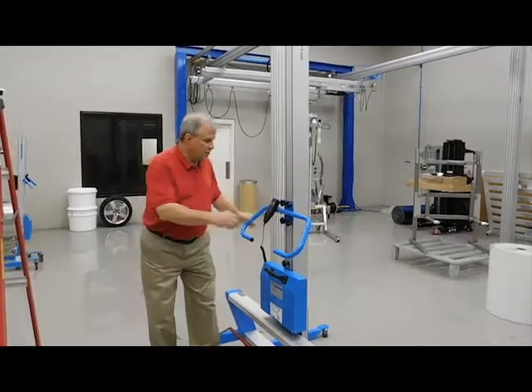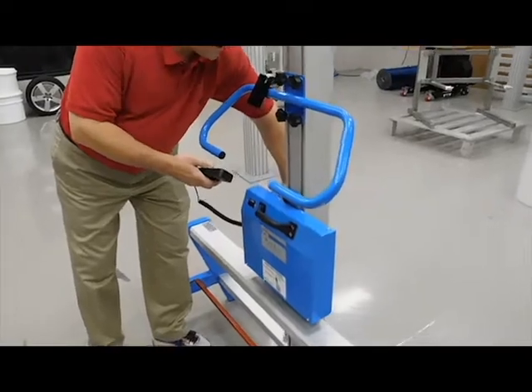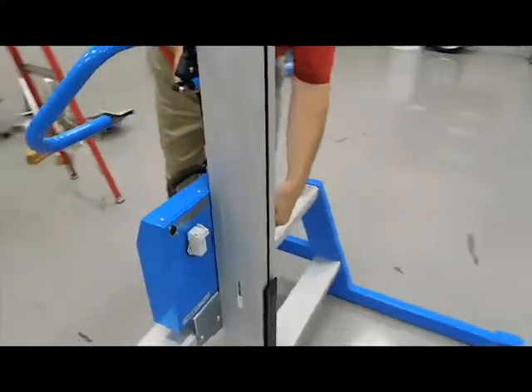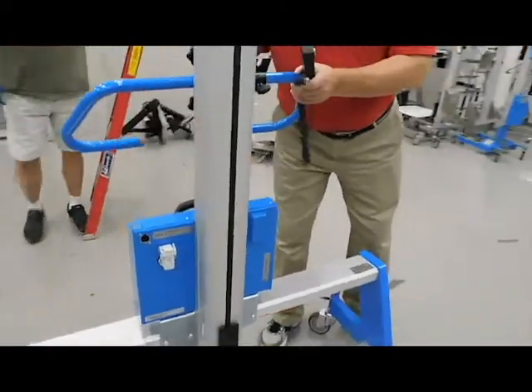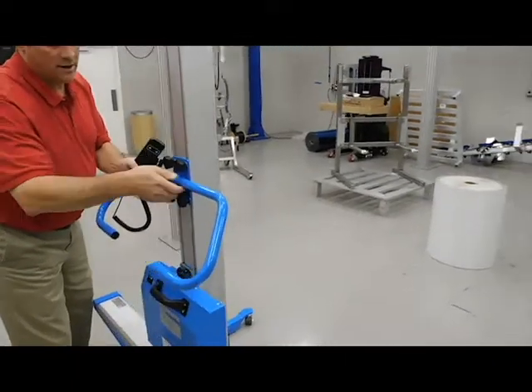The first thing that you would do is disconnect the 2-button remote from the back of the power pack. So that's done. And then there is a power cord in the back here that we're going to disconnect from the power pack. So that's done. And now we're going to get Craig to come over here and we're going to take the handlebar off. You have to take the handlebar off through the top of the mast.